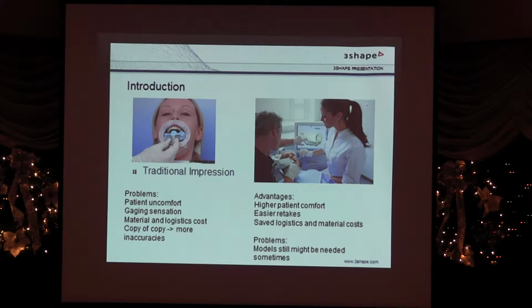But again, it works, but now we have these intraoral scanning systems, which are so successful and so advanced, and on top of that, higher patient comfort, easier retake. If you miss a spot, you can just go right back and scan that spot, and it will stitch itself, and the lab is going to get a perfect impression that captured all the detail. And then also you can save the logistic cost.